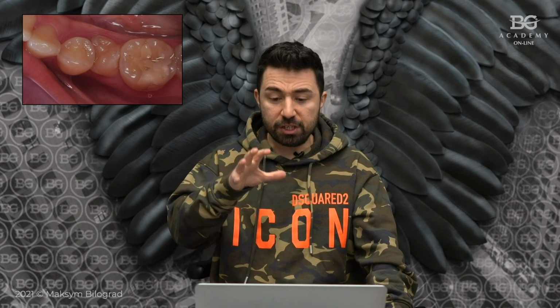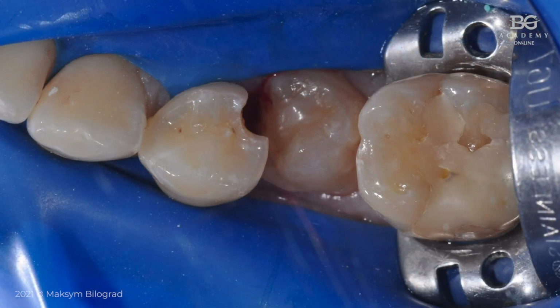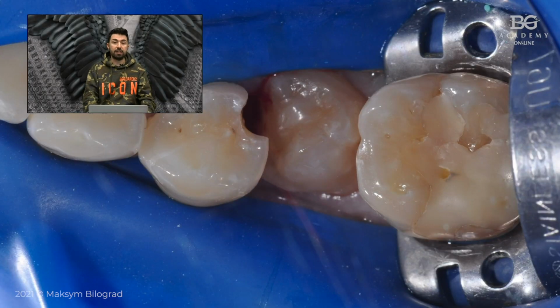Fine, okay, so this is our initial intraoral situation. You can see the second premolar that is not erupted and the isolation that we provided. We are not able to do classic isolation with normal single tooth isolation because we don't have the possibility to invert our rubber dam between two premolars. So we decided to do a split dam, okay?